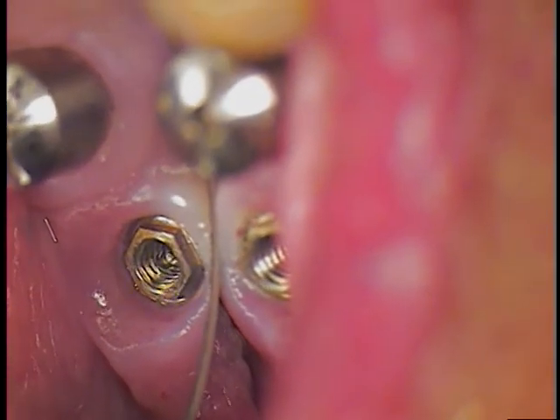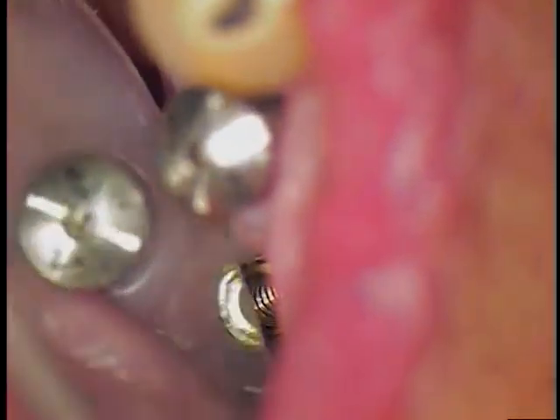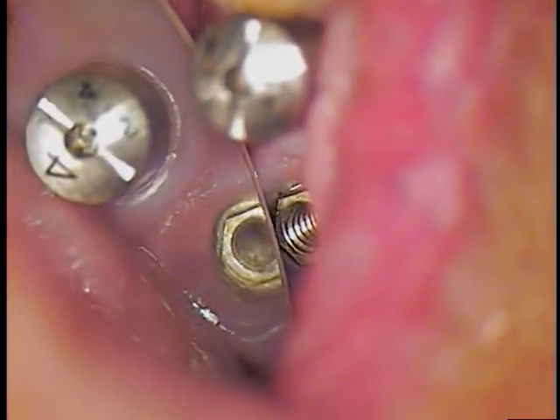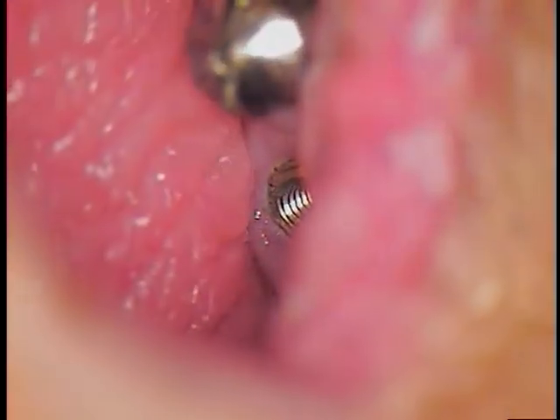You can see the threads on that — I'll work on that one as well, all the way to the buckle. Here's our next healing abutment. Two down, one more.